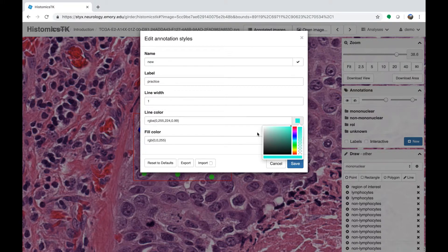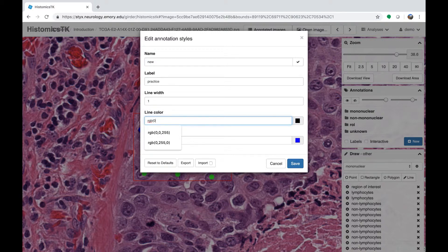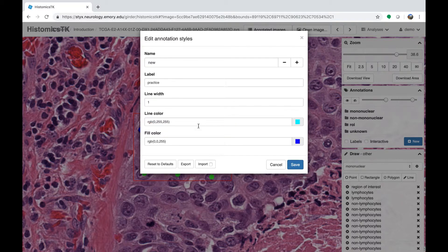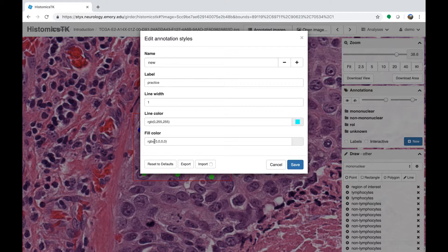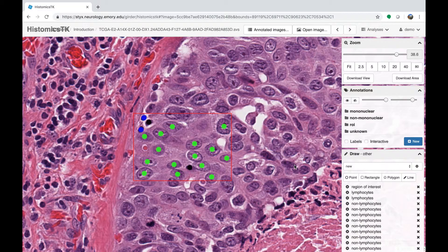The fill color is represented by a triplet of numbers for red, green, and blue. You can either edit this manually or use the color picker to do it graphically — adjusting the hue with the rainbow bar, the saturation in the left panel, and the transparency on the right. For a blue-green color, you can manually enter values of 0, 255, and 255 and hit Enter. For the fill color on rectangles and polygons, set it to black and full transparency, which produces an RGBA value of 0, 0, 0, 0 — that last 0 represents the transparency. Click Save.